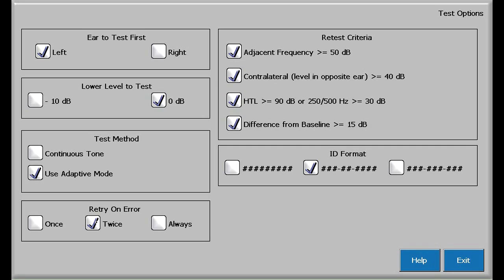The retest criteria, if checked, allow the audiometer to automatically retest hearing thresholds that differ from the adjacent frequency by 50 dB or more, differ from the opposite ear at the same frequency by 40 dB or more, exceed 90 dB at any frequency or 30 dB at 250 or 500 Hz, and differ from the employee's baseline if entered in the audiometer by 15 dB or more. I recommend selecting all retest options.